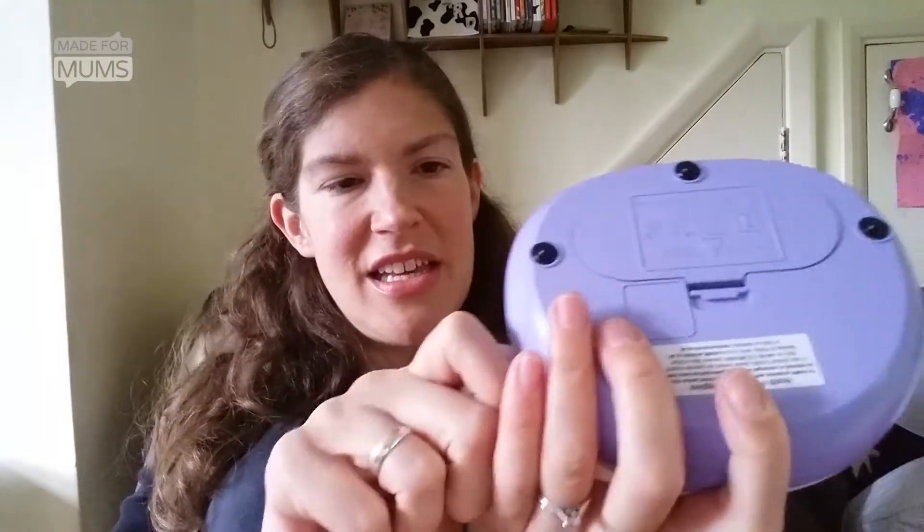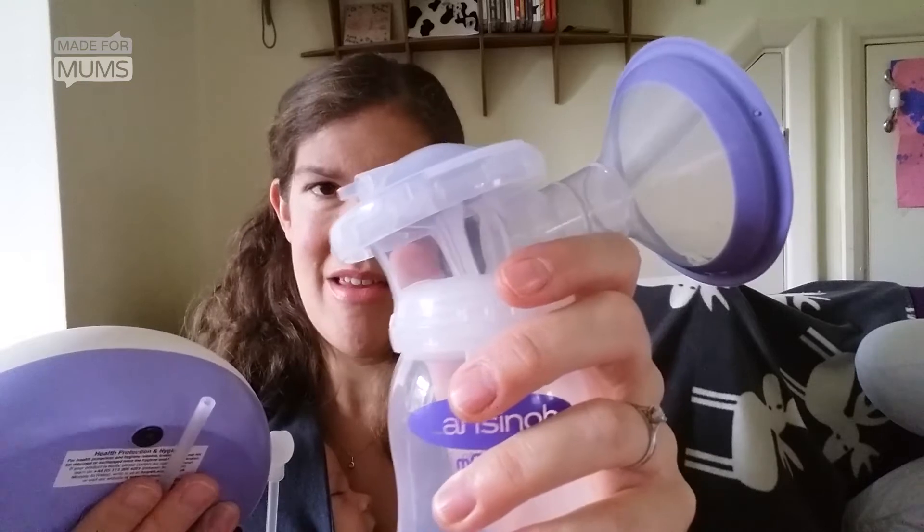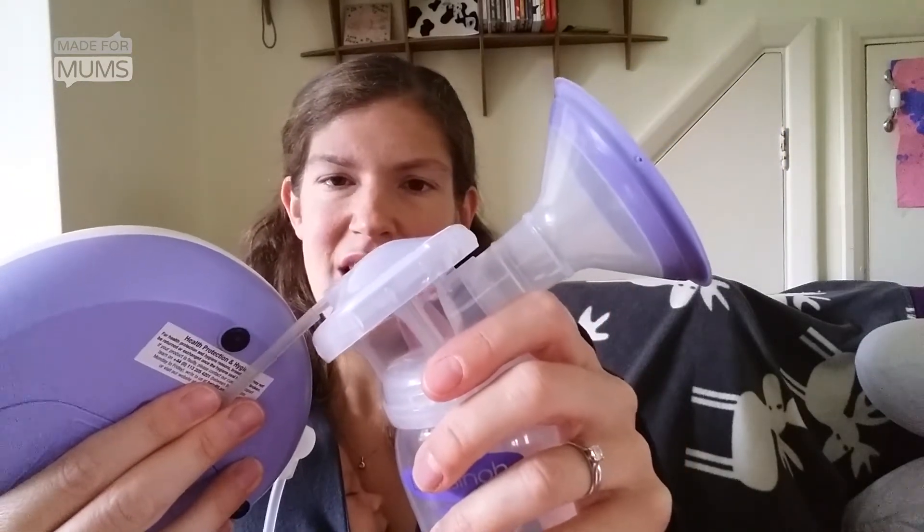Next up, you connect it to your base pump — there's a little tube that just fits in the side like this. You'll see on the other side it's got the lead if you want to use it at home rather than battery operated. You plug the lead in there, put your tube in, and then on the lid of the breast cushion body part you can see there's a little jutting piece outwards — you simply connect your tube to that and you're good to go.